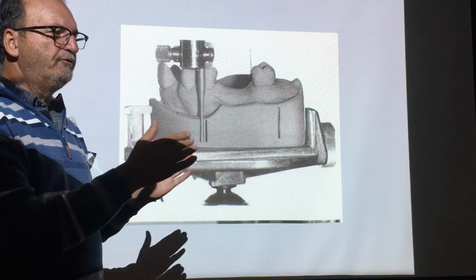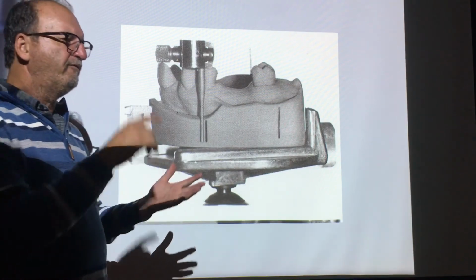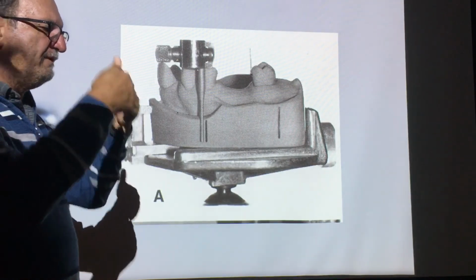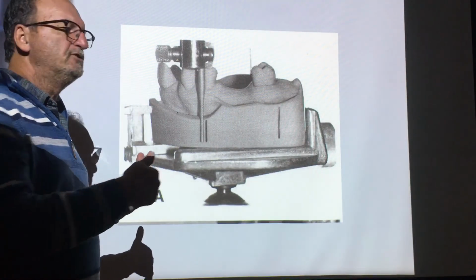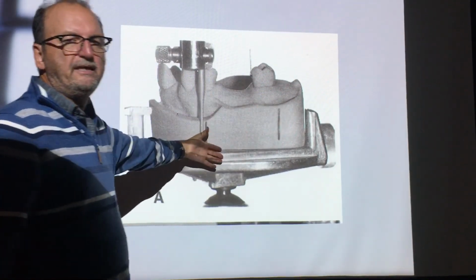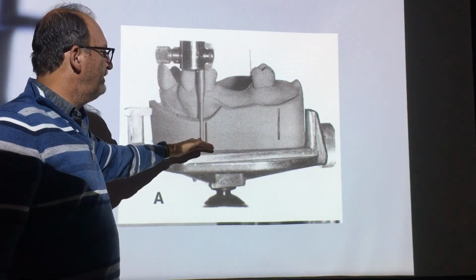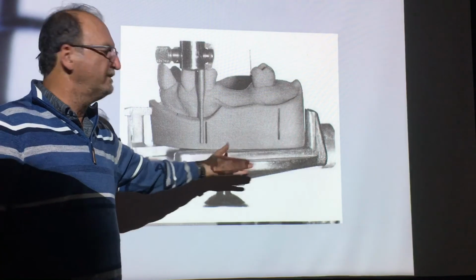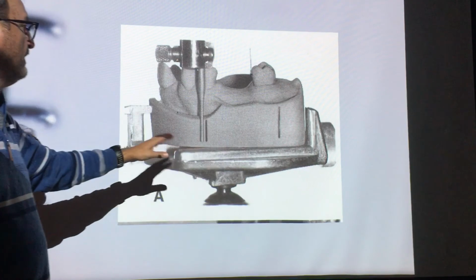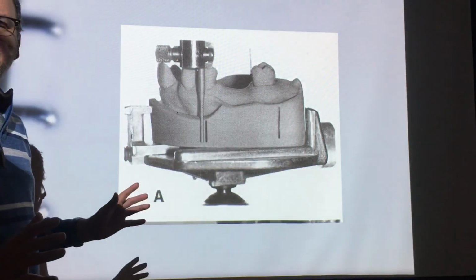plane of occlusion. So if your model is not flat, from a thick base, it's always imperative, whether it's full dentures or partial dentures or even crown and bridge models, that the base of the model be parallel to the plane of occlusion. So if that's off, the table might be flat, but my teeth are on an angle because you didn't make a base flat enough. So eyeball the plane of occlusion parallel with the base. Most likely you'll start at a set 0, this table at 0, meaning not tilted anterior, left or right, or posterior.